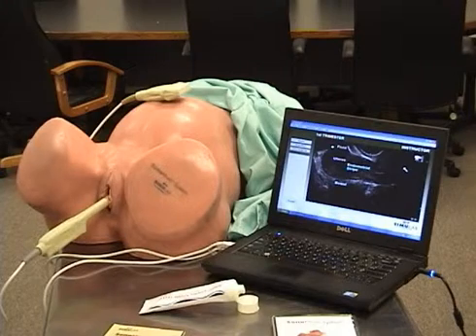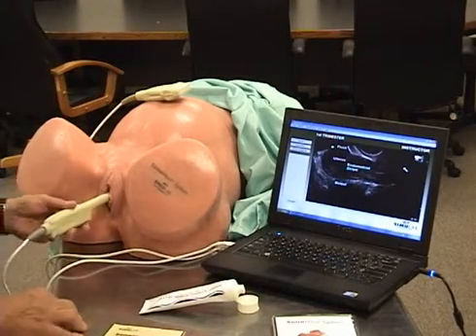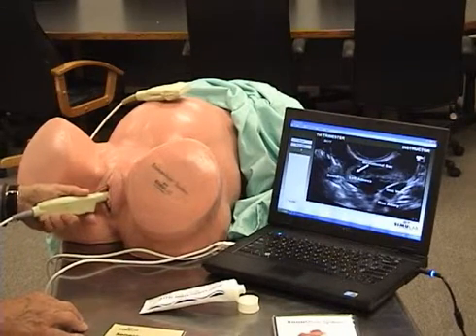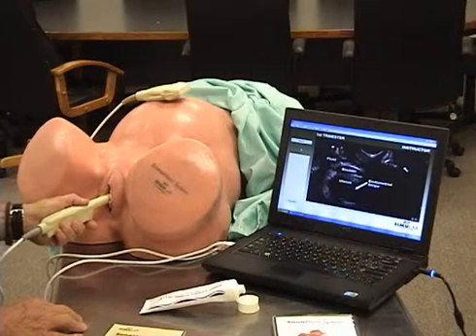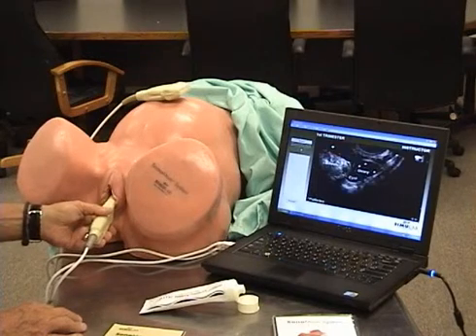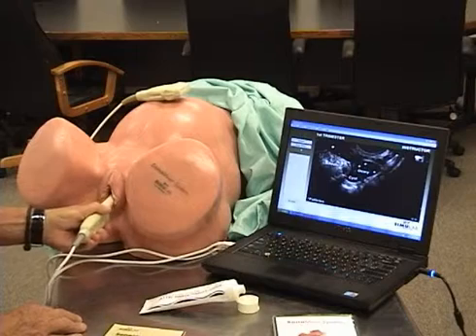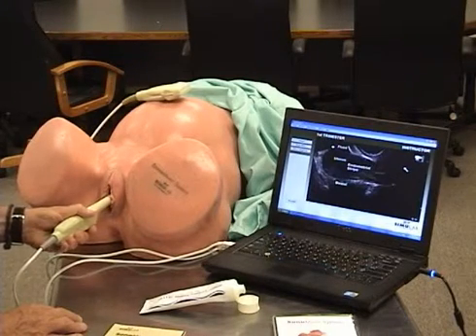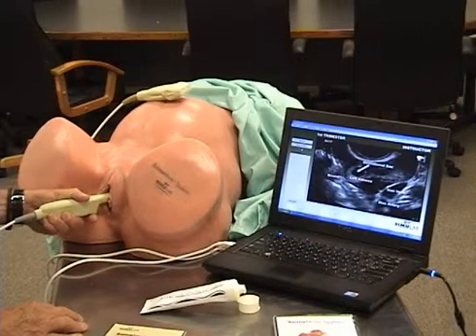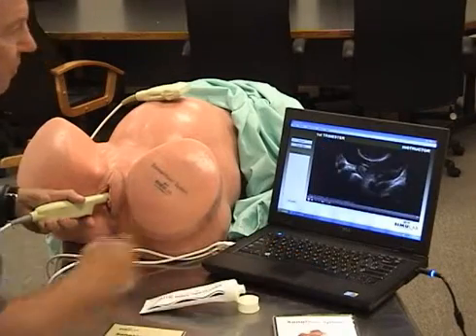So you insert the transvaginal probe into the vaginal cavity, and you can get different views. You get 5 separate views, whereas you scan or span across the vaginal canal. So 1, 2, 3, 4, and 5. And this, of course, gives you a video in each location.